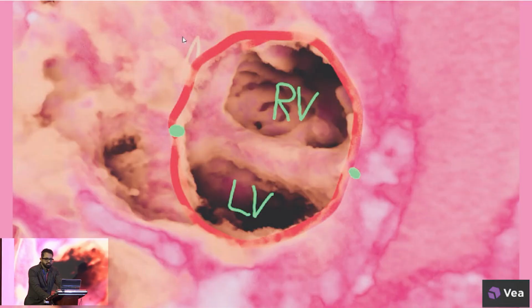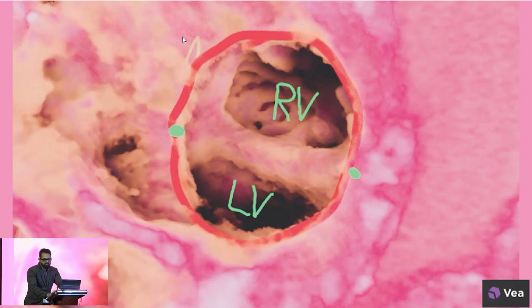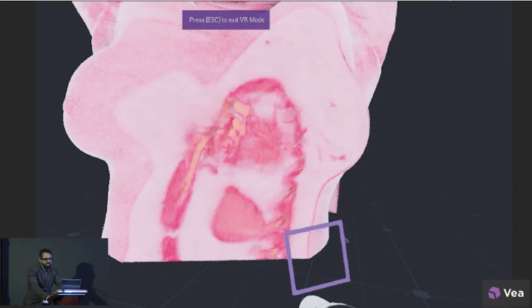This is the surgeon's view. The surgeon is getting inside the atrium and looking at what he would see in the surgery. The aorta is in the 9 o'clock to 11 o'clock position. He plants the baffle, and this is the kind of baffle simulation that we prepared for the surgeon to be prepared for this particular surgery.